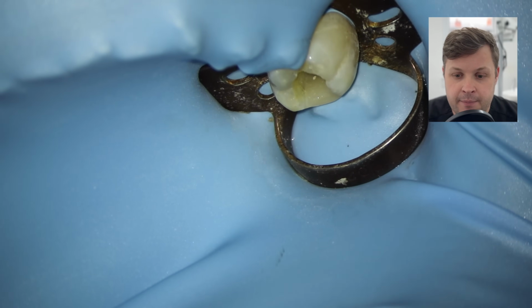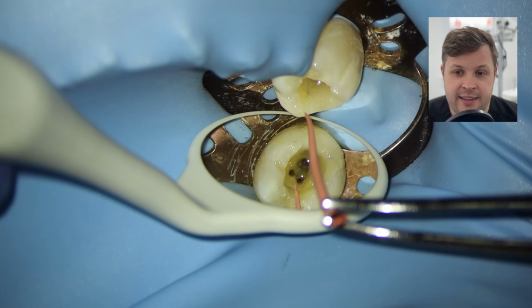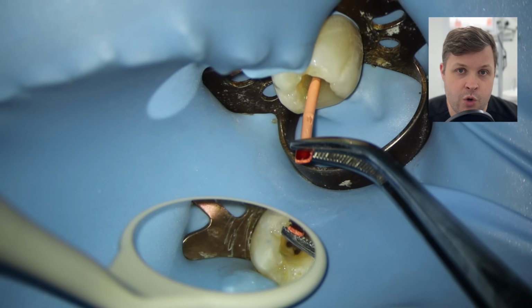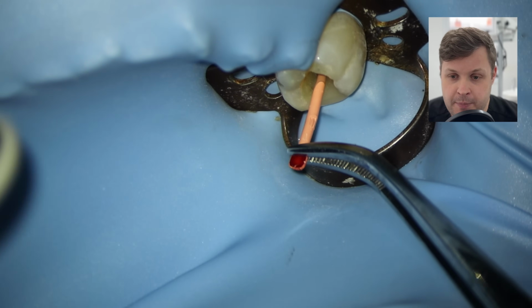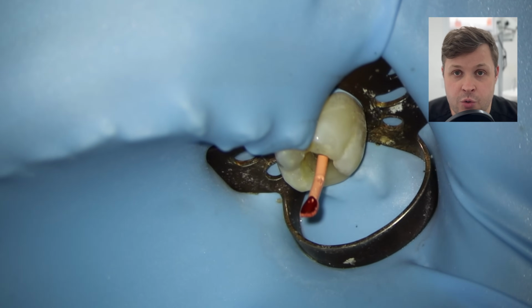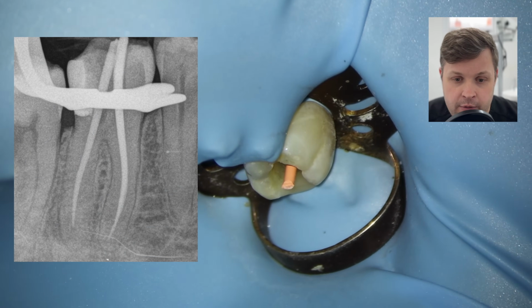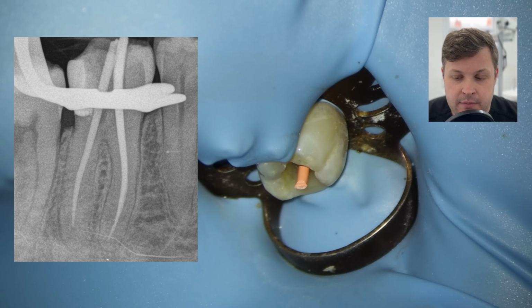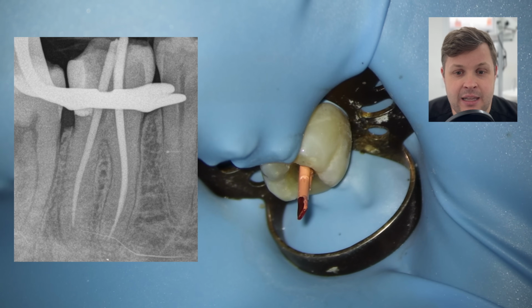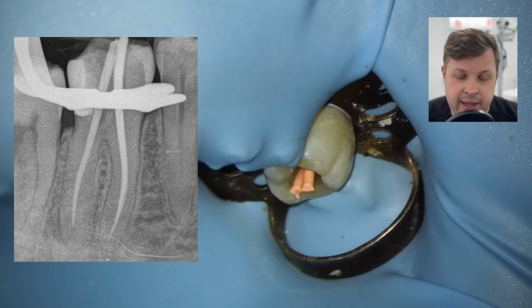When we place the distal cone to length, it feels like it is now reaching the designated working length that we've worked out with our apex locator. And then essentially we just place the cones in the other two canals. And when we look at the cone fit radiograph, we can see here that the end of the GP point in the distal canal is quite a significant way away from the radiographic apex.